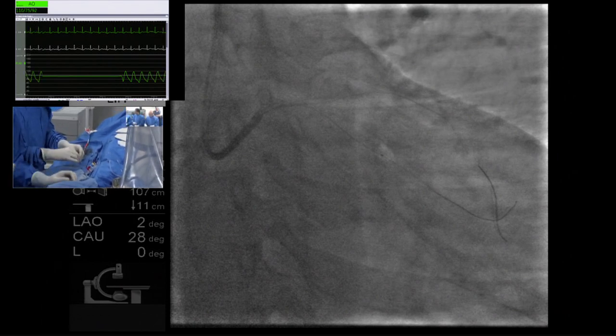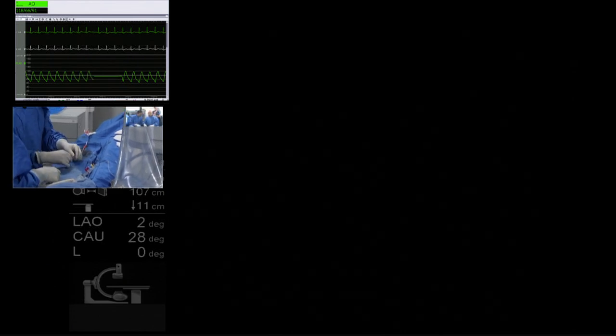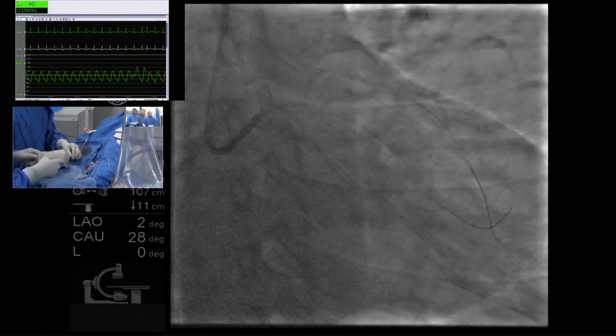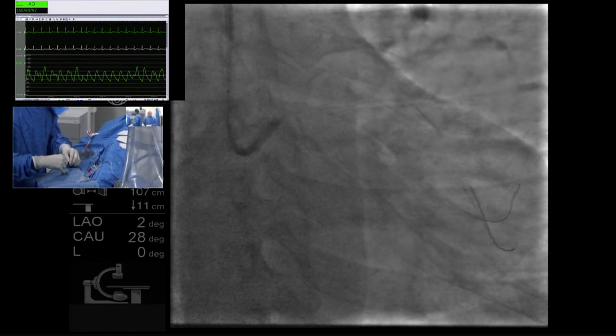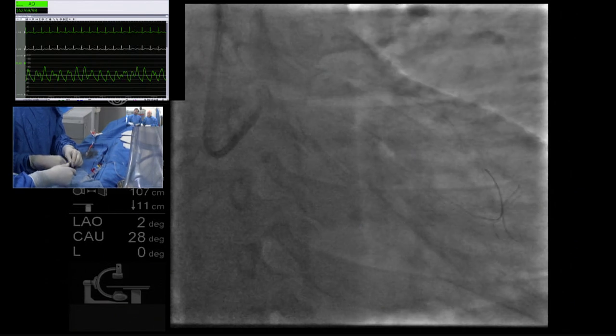1.25 or 1.2? Yes. Okay. 1.25. I can refer this out to other members of the panel while Dr. Saito works. Does anybody have an algorithm that they want to share on wire cross? 2.5 millimeter balloon open? There are three steps you could do. 1.25 open, 2.5 trapping. It depends on how much money you want to spend and the situation you are in.